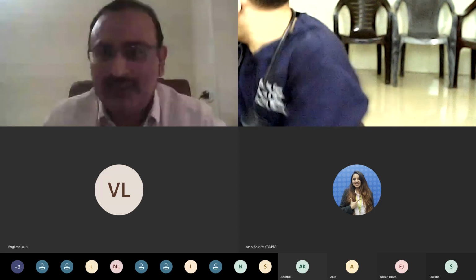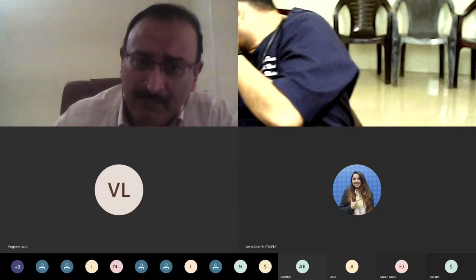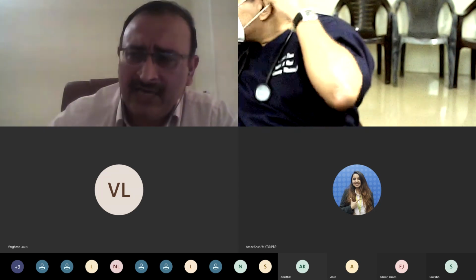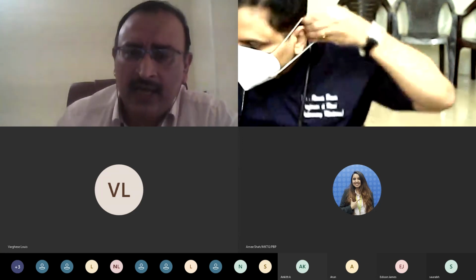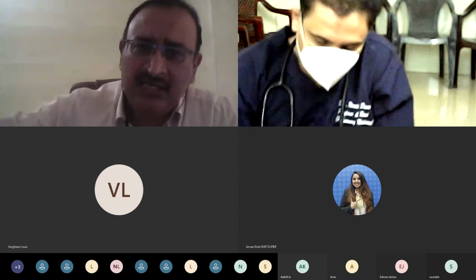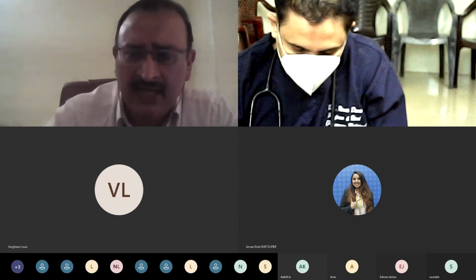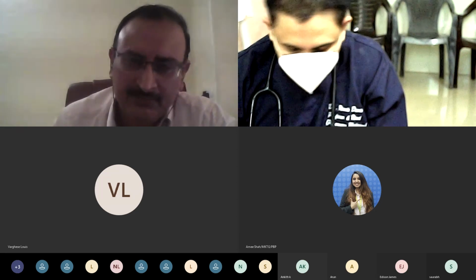So currently what people do is go by experience. We'll start off with a PEEP of 5. If somebody is definitely going to need a lot of oxygen, I'll start off with a higher PEEP. And if it's an ARDS patient, I'm not bothered about the blood pressure at all, so it might be 8 or 10. Then I'll look at the blood gas after half an hour, 45 minutes, and then decide upon things. So 5 will be my minimum.